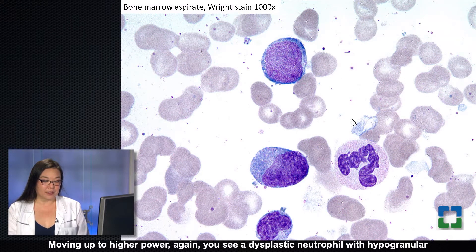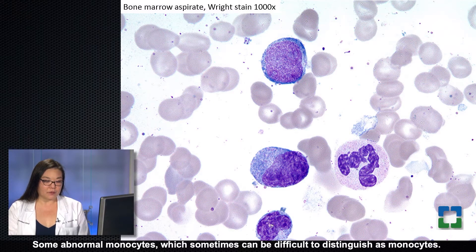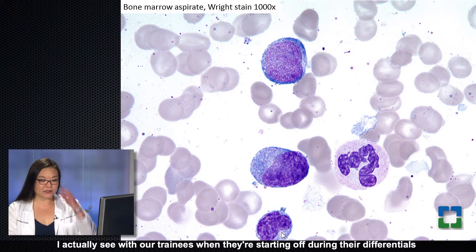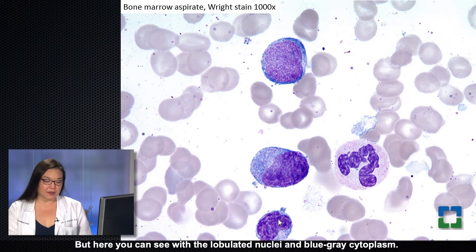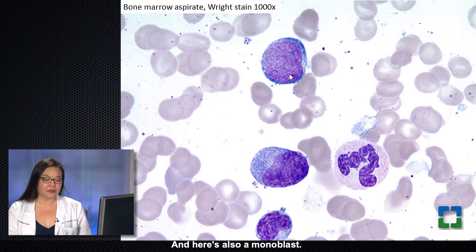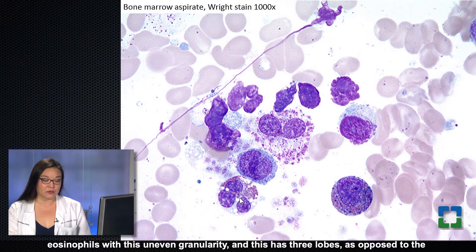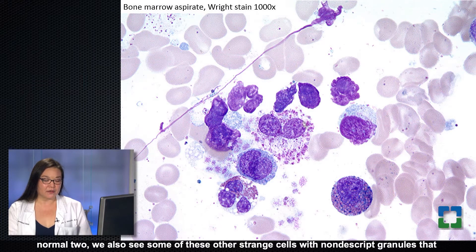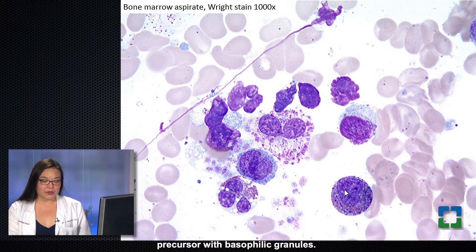Moving to higher power, you see a dysplastic neutrophil with hypogranular cytoplasm and a tendency towards hyperlobation of the nucleus, some abnormal monocytes — which can be difficult to distinguish. Trainees often undercount monocytes, but here you can see the lobulated nuclei and blue-gray cytoplasm, and here's also a monoblast. In addition to these abnormal eosinophils with uneven granularity and three lobes, we also see strange cells with nondescript granules that don't resemble anything normal in the bone marrow, as well as another eosinophil precursor with basophilic granules.